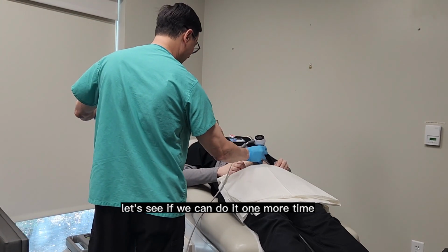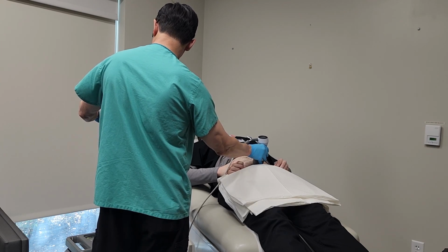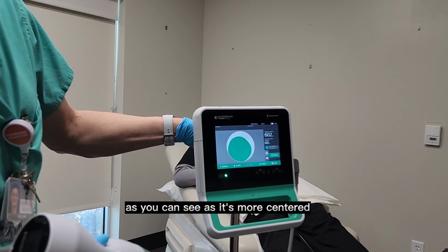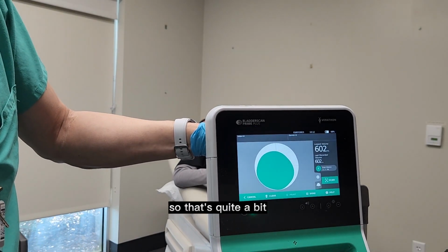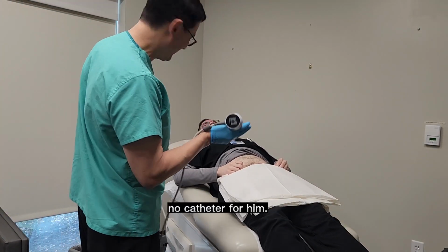Let's see if I can get a slightly better scan by tilting it up some. Okay, and there you go. That's a better scan. As you can see, as it's more centered, it's green also now, and we got 602, so that's quite a bit. So he's retaining. Next for Miss Ayel, we'll be putting in a catheter. No, I'm just kidding. No catheter for him.